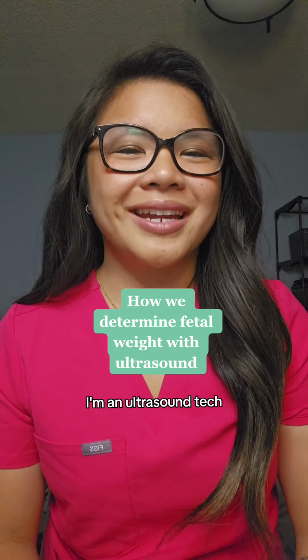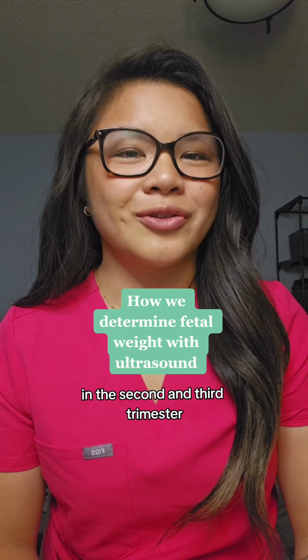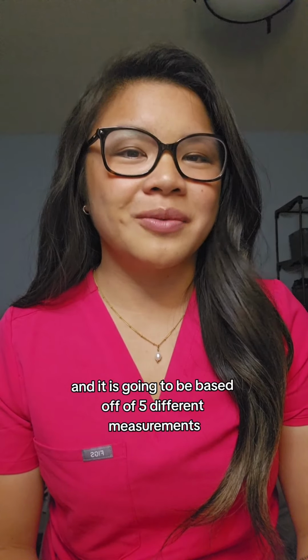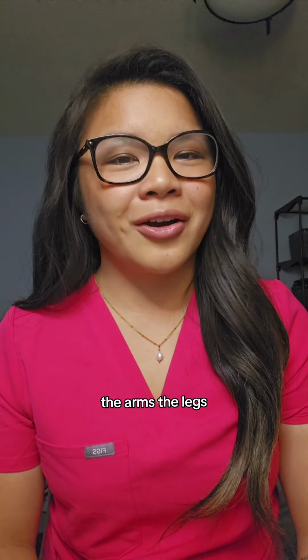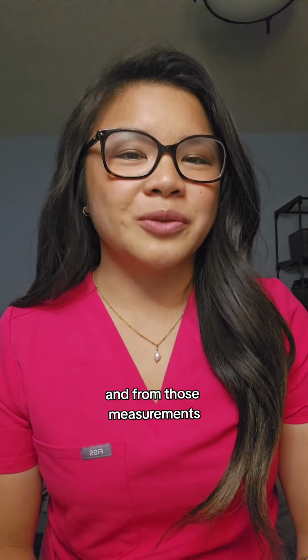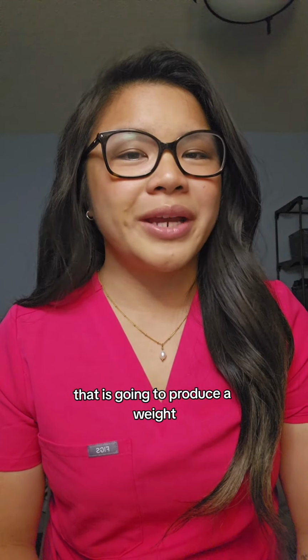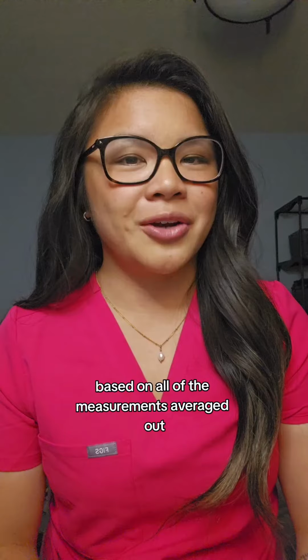I'm an ultrasound tech, and this video is going to be geared towards how we determine baby's weight in the second and third trimester, and it is going to be based off of 5 different measurements. We are measuring 4 structures: the head, the arms, the legs, as well as baby's tummy. And from those measurements, that is going to produce a weight as well as a gestational age based on all of the measurements averaged out.